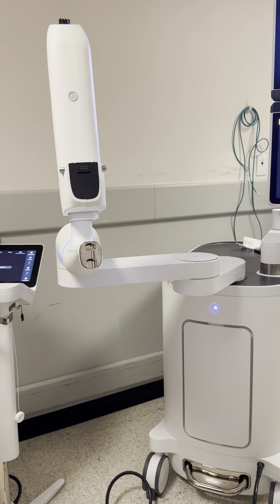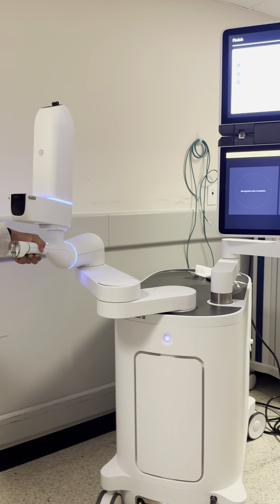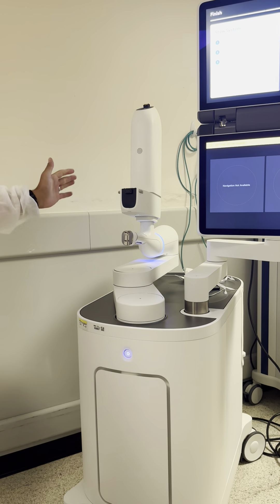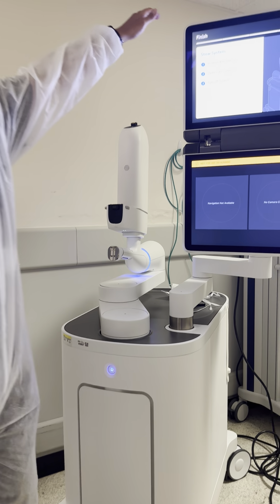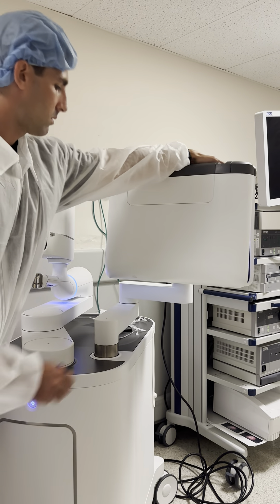The last three steps: position the arm over the cart. This is important because once the machine is turned off, the arm can't be moved, and we want to keep it over the top of the cart for safety purposes during transportation. Now that the arm is over the cart, we can close the monitors as well, and position these two over the cart.